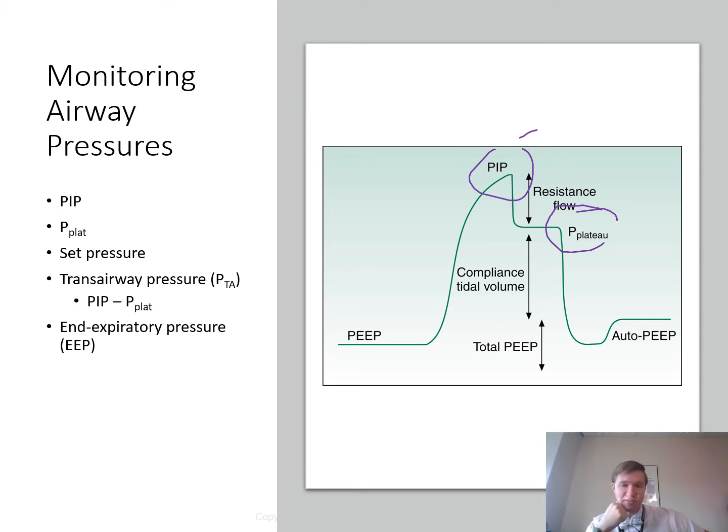Elastance is the inverse of compliance. So that means that the higher the plateau goes, the lower your compliance is, roughly. Very simplified statement. Obviously, understand there's more detail that goes in there, but that's a good starting point, right? Until you get to the more detail of it. But the higher the plateau, the lower the compliance, traditionally.